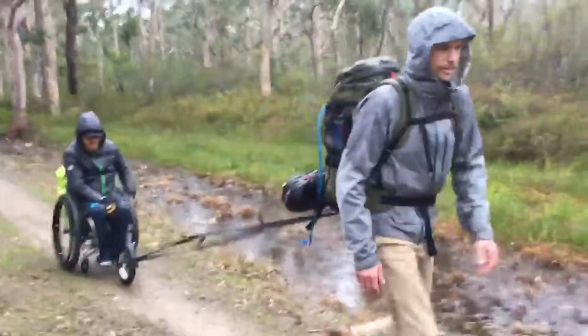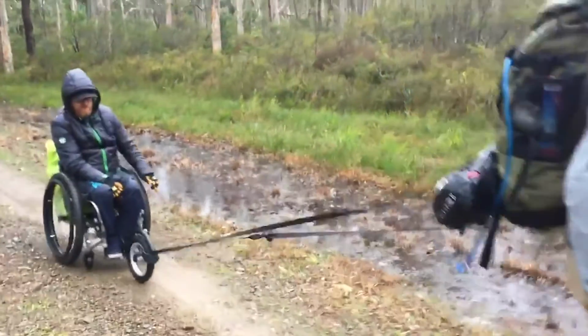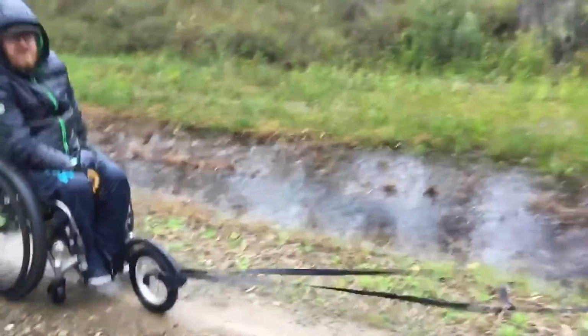Hi, I'm Helen. Today I'm going to run through with you a technique that we're calling huskying. It's basically a fun and social way of helping someone that uses a wheelchair on a bushwalk. It's a technique that's really helpful on sections of terrain that are maybe quite steep or a bit rough, or perhaps you've got to the end of the day and are a bit tired.